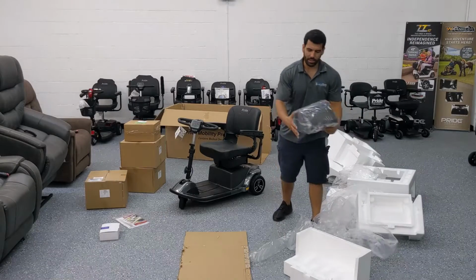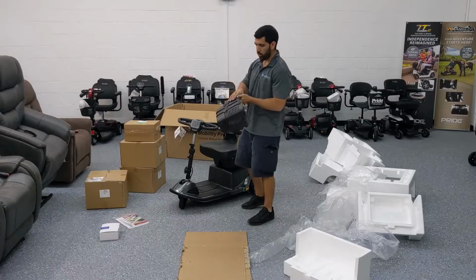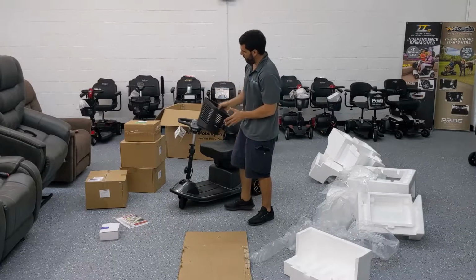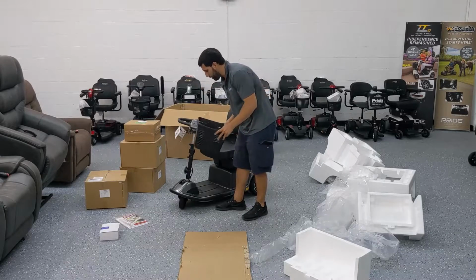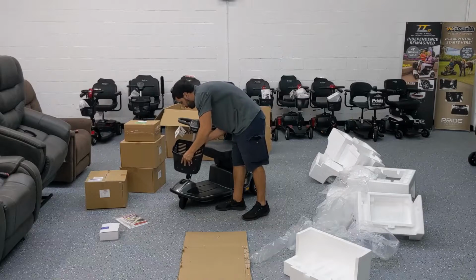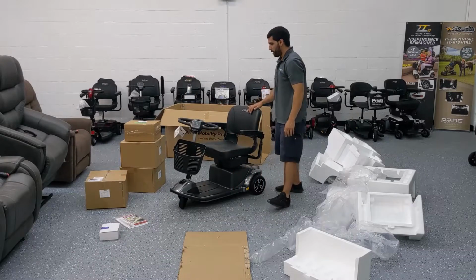Almost forgot about the basket here. The basket clips on. There are two little rails here on the back, and the hooks just slide right under it. You can see the two hooks here. You line it up with the two railings, and it falls right into place without any tools necessary. So it doesn't click or anything.